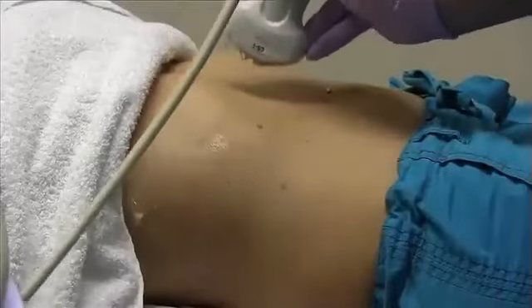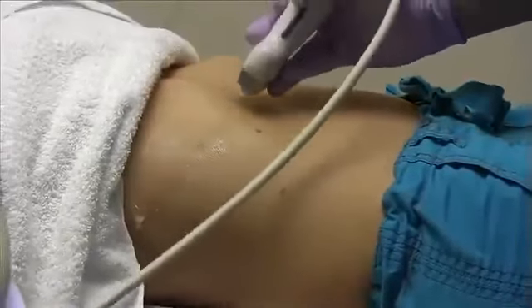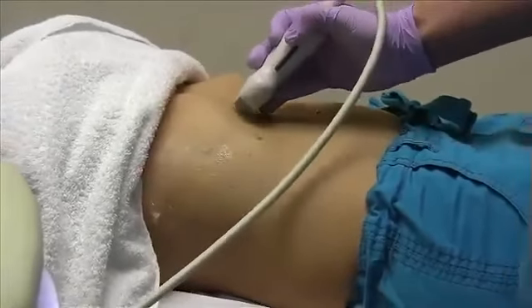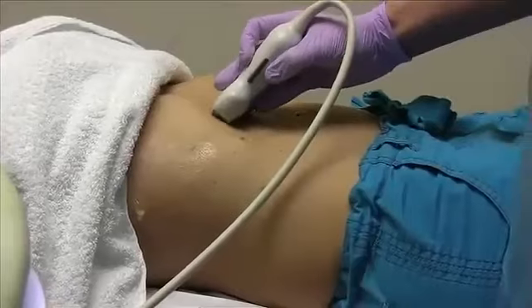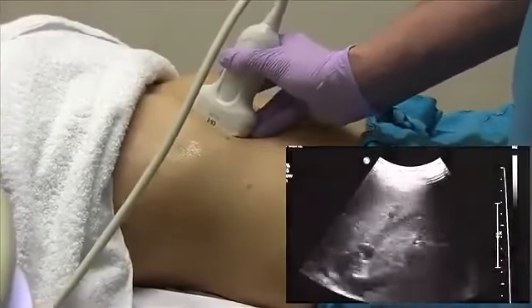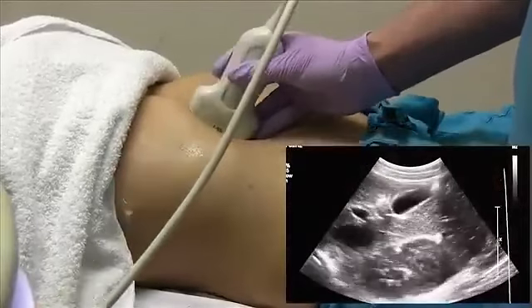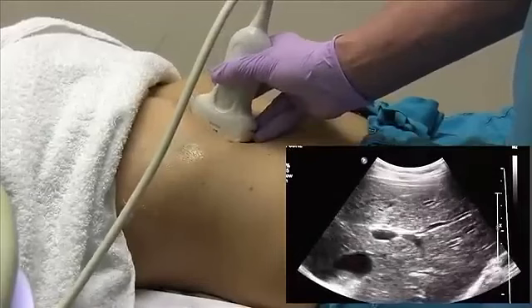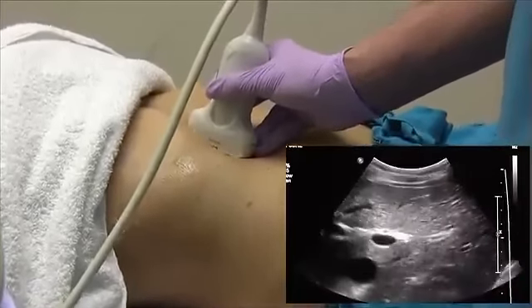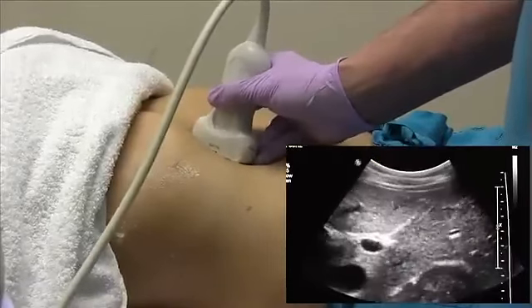Next, we're going to show you how to image the gallbladder, and you can really use two windows depending on which one works best for the particular patient. One of the two windows that I usually use is a subcostal window, and your probe may be slightly obliqued to the patient's body, but essentially what you want to do is open up the gallbladder completely.